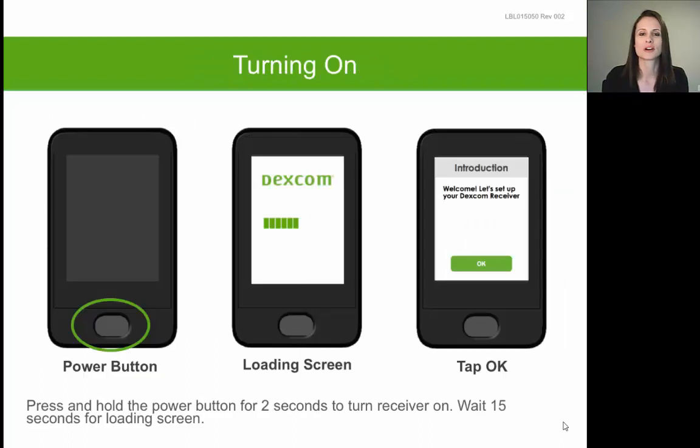In this webinar we are going to focus on how to set up the G5 touchscreen receiver. To turn your receiver on for the very first time, you're going to press and hold down on the power button at the bottom of the device for about two seconds. This will result in the display of a loading screen.